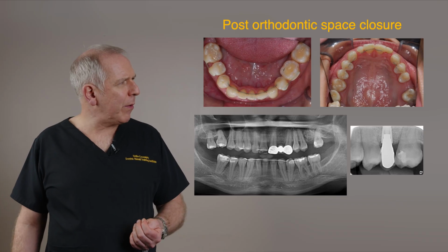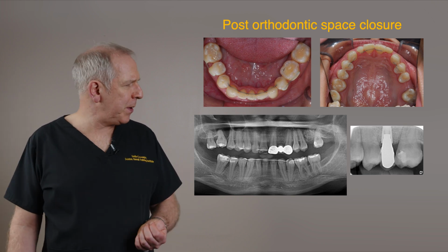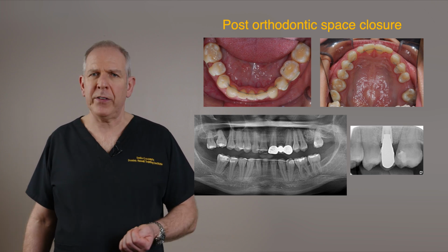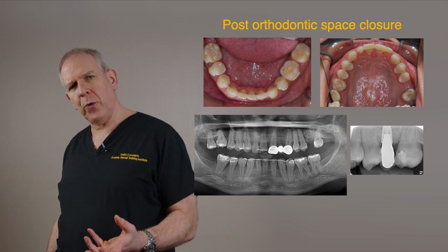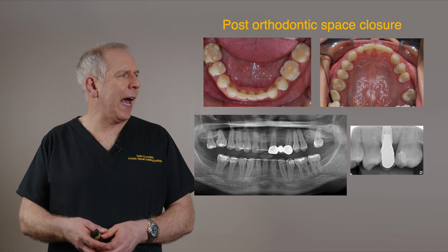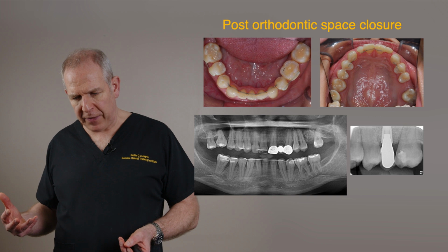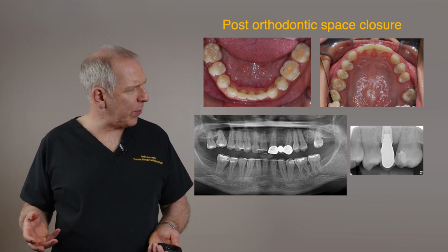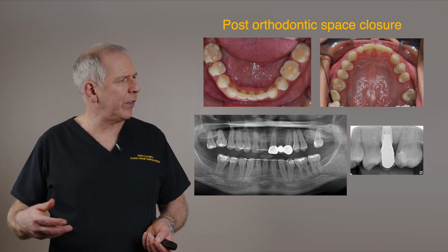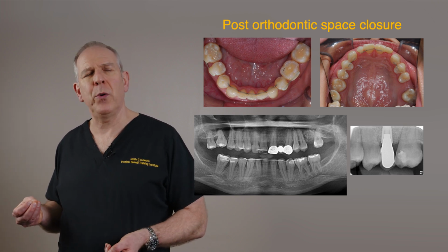And so where are we going with this case? Well, we had the residual space up on the left, but you can see what the orthodontist has done for us is close all the other spaces. So that's reduced the restorative need for this patient by closing the spaces. Now, we couldn't do that top left, and you can remember from the first slide that we had a very, very compromised situation with pneumatization of the sinus. So what we've undertaken here is a sinus lift, implant placement, and an implant crown to restore that space there.